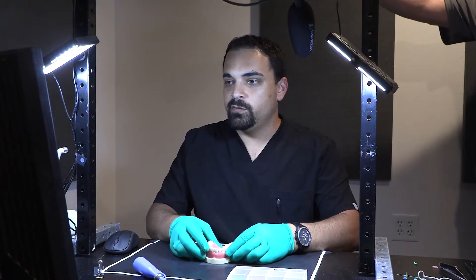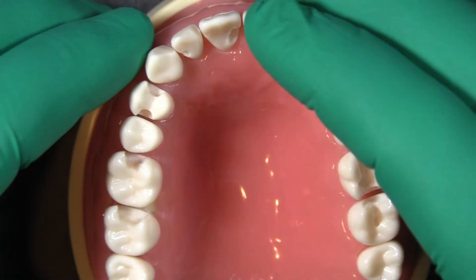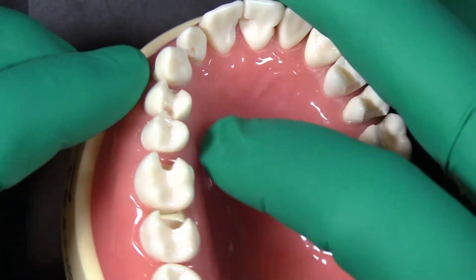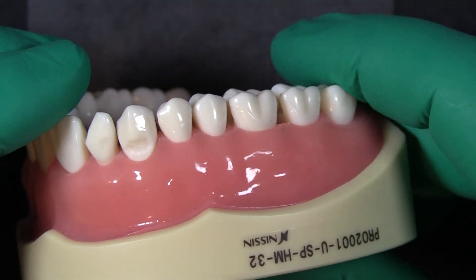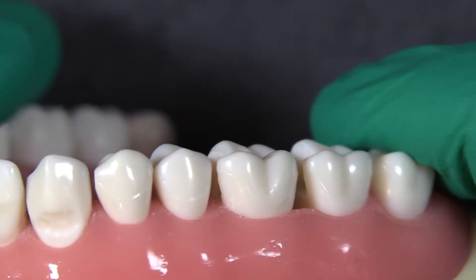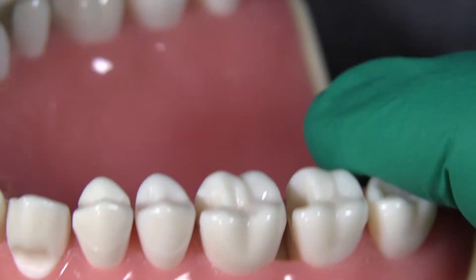For these restorations we have something much deeper than your standard class 2 restoration — something going either at the gum tissue or beneath the gum tissue. You can see here that the prep goes all the way down beneath the gums. On this one it doesn't go beneath the gums because I've already removed some of that gum tissue.